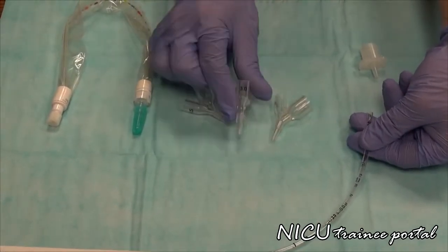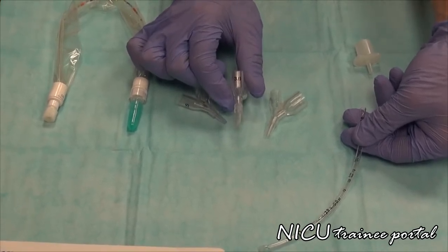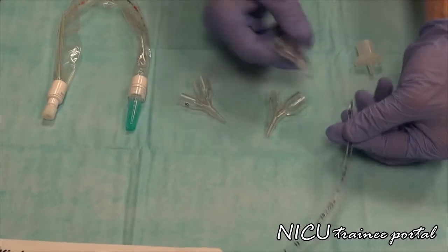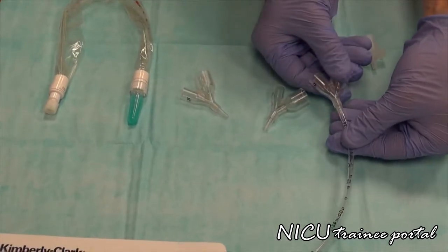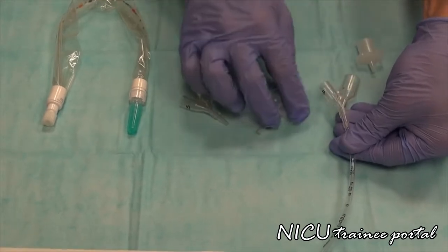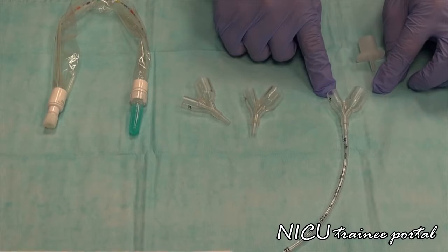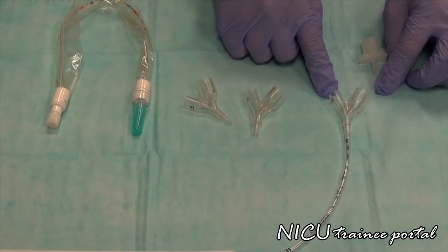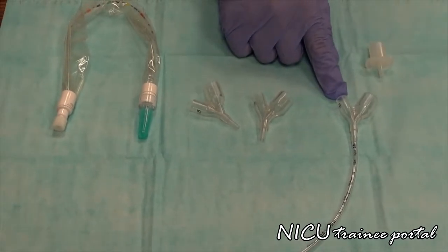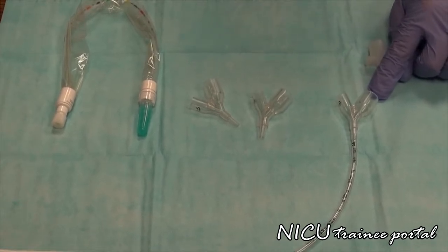You then get the appropriate size surfactant adapter, which is the 3.0. You put that where your original adapter was, and then we have the setup here where we have one port for our catheter, this one in front of my finger, and the other port would be for your manual bag or your ventilator circuit.